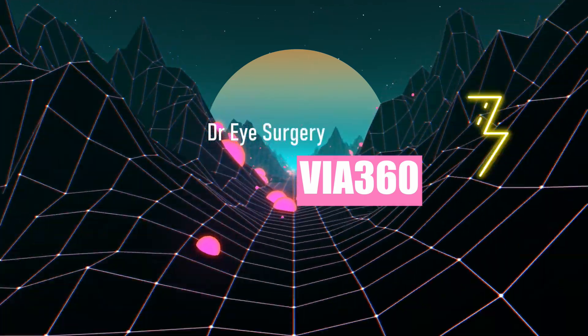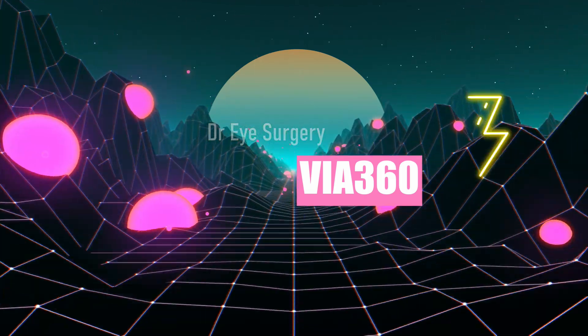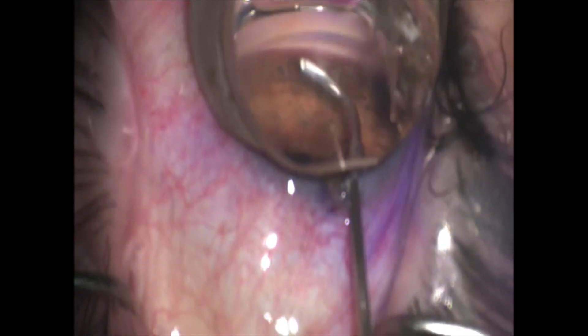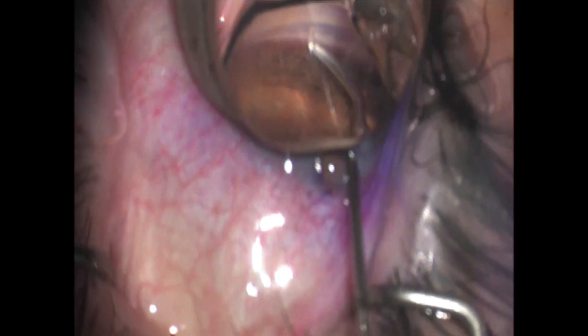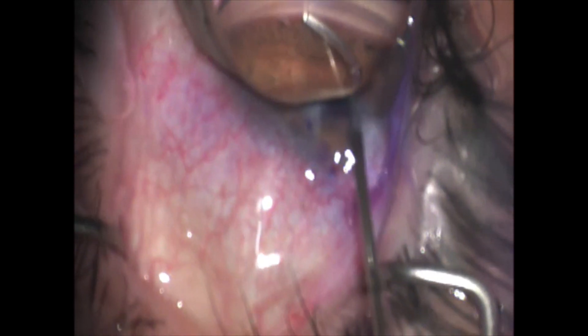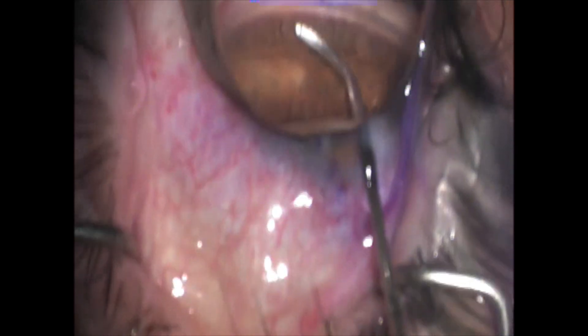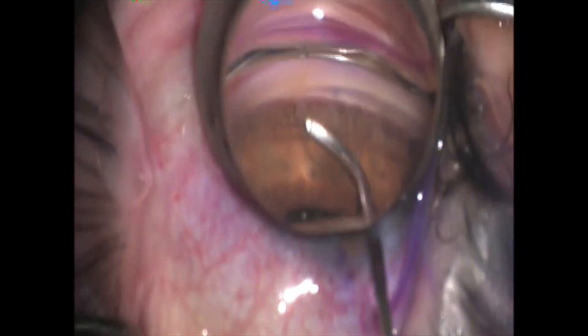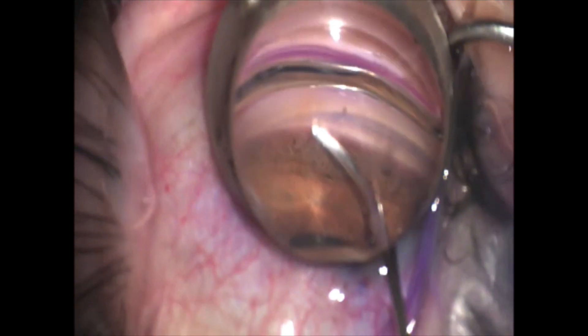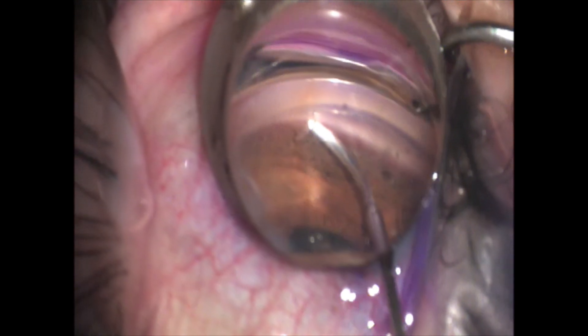This is a video demonstrating the new VIA 360 by New World Medical. It's the newest canaloplasty device on the market currently. Just like every other canaloplasty device, my goal here is to open or lightly score the trabecular meshwork to give me an insertion site for this device to go.